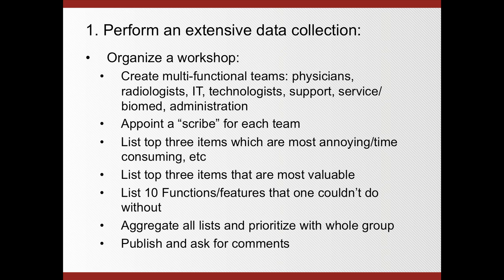So you want to get the multifunctional teams in a big room, and if you have a large institution that potentially even has multiple hospitals, it could be quite a big group. I've seen groups sometimes up to 40, 50 people. Now, if you have a relatively small institution, it might be just a 10 to 15 people team. So you have one or multiple teams. You want to appoint a scribe, somebody that is guiding that little team of 10, 15 people, and go through all the different components.